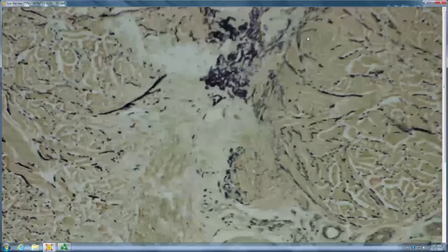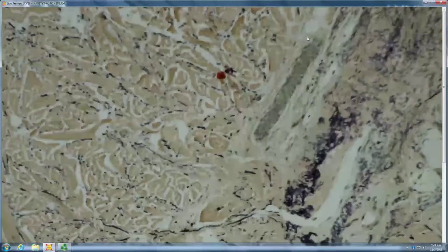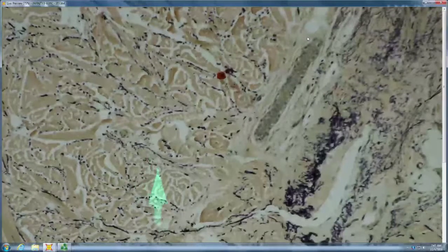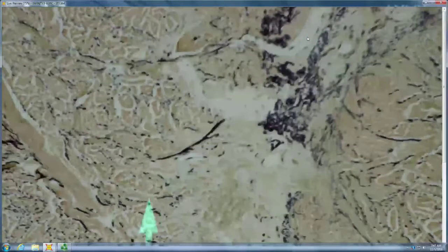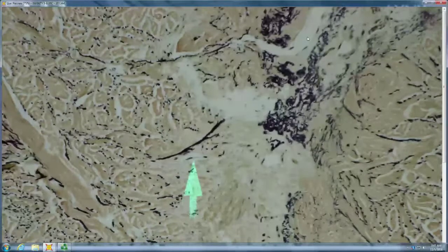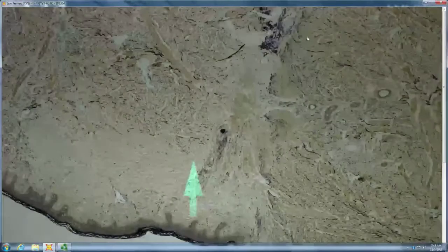Yeah, you've got a wedge-shaped scar. And not only do you have a wedge-shaped scar, but you can see what normal elastic fibers look like, right? So if that's normal, why are these so thick up here? Because they're recoiled where they were snipped, right? So that happens on the edge of where the scar is, and then the scar itself is a superficial wedge.